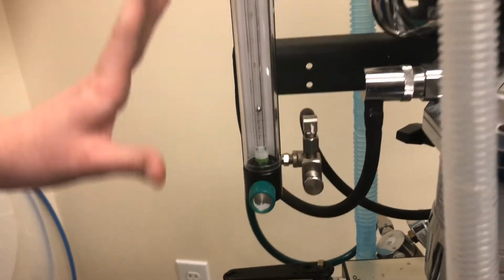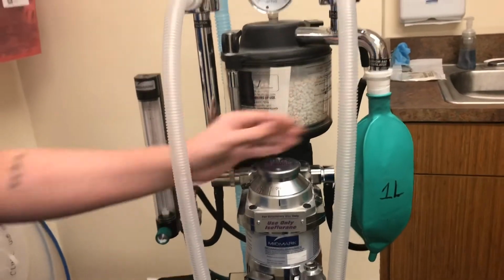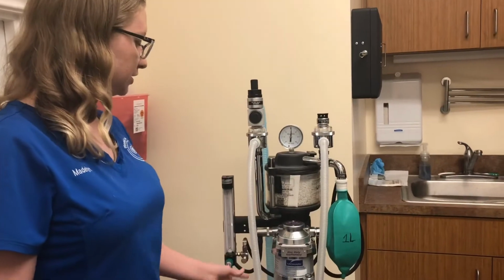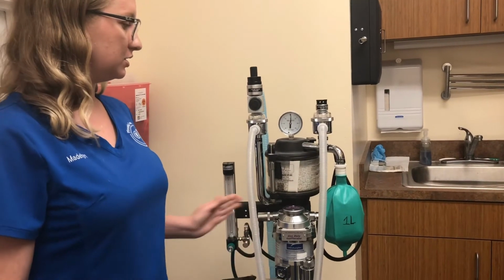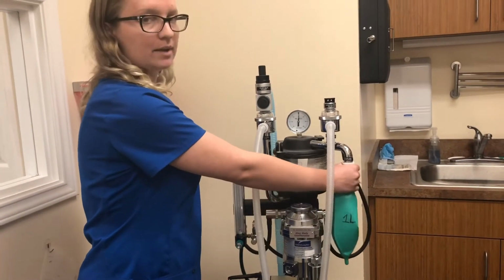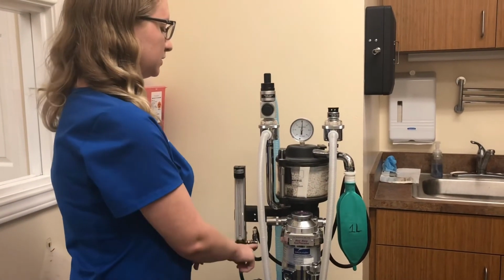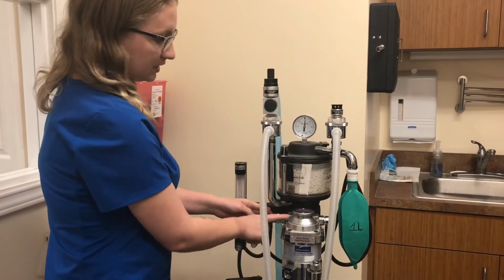The oxygen will flow into either our vaporizer or it'll bypass the vaporizer and go straight to our reservoir bag. To bypass the vaporizer, you hit your O2 flush valve. You'll hear the oxygen bypassing straight through this and into the reservoir bag. If you want to give your patient just pure O2, like if they're in recovery from an anesthetic procedure, then that's when you use this. If it's not bypassing, it's going through here into our vaporizer.